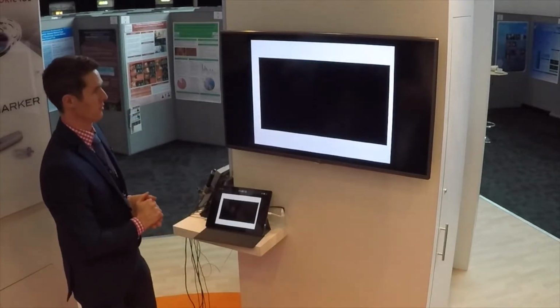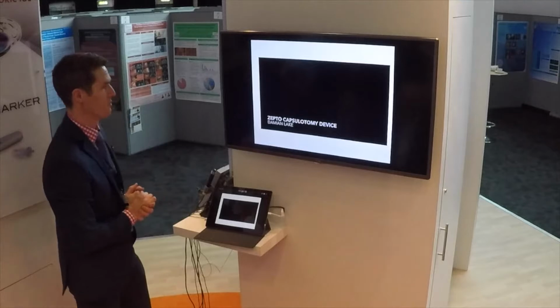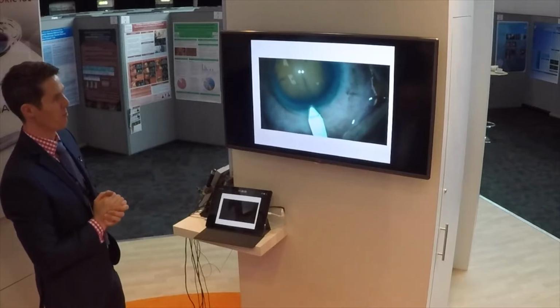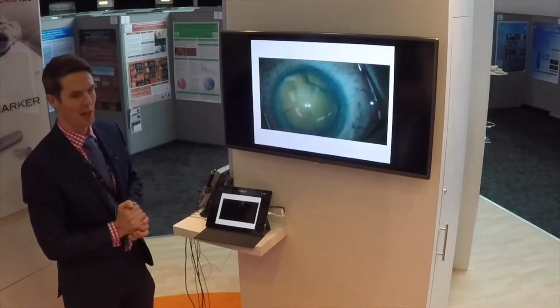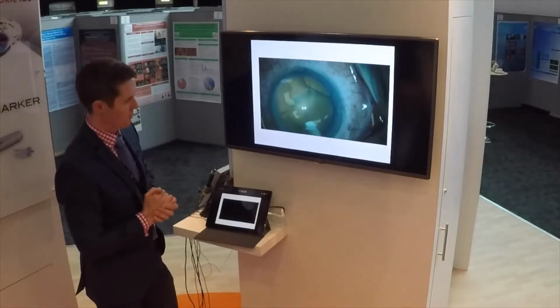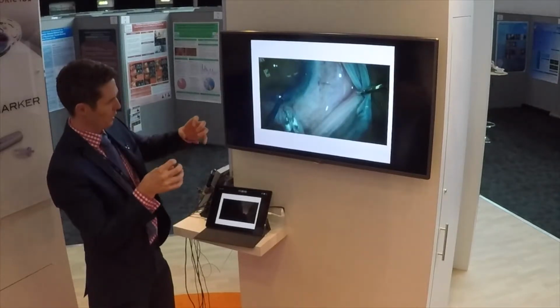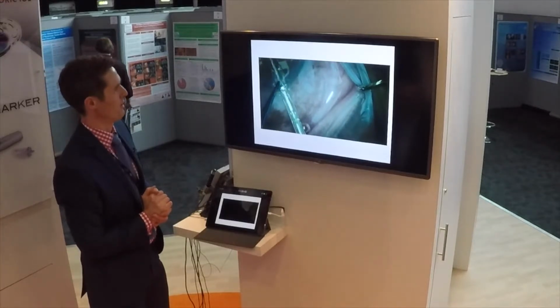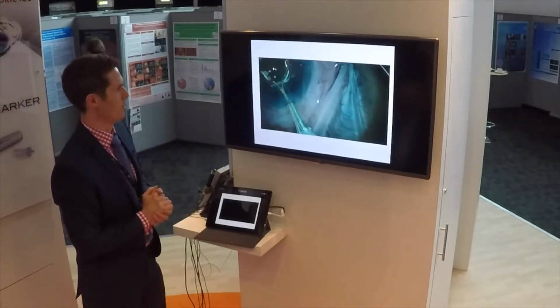So, clinical experience. I've done a few eyes with this instrument now, and I hope my video is going to play. This is my first one. We're using our backup microscope at the time, and the recording fails at the end, but we get most of what we need. So this is showing the Zepto handpiece. We retract it back so that it becomes more longitudinal. I'm a bit reticent because it's my first case, but I managed to get it through the 2.2 wound. Goes in relatively easily. Then you place it.